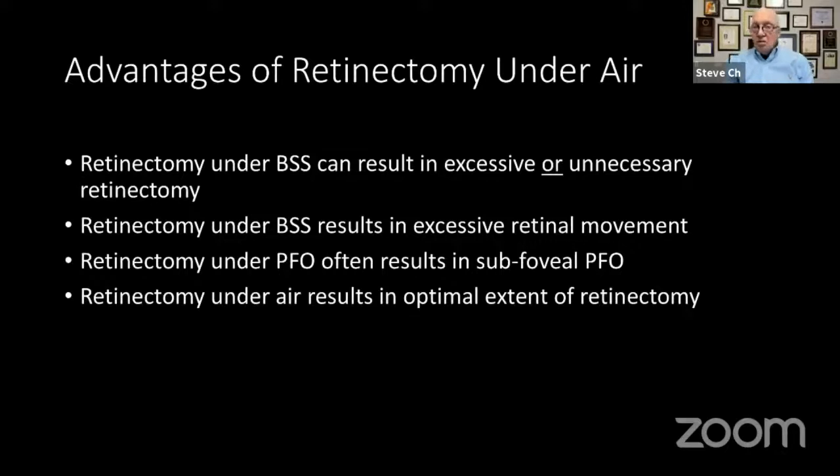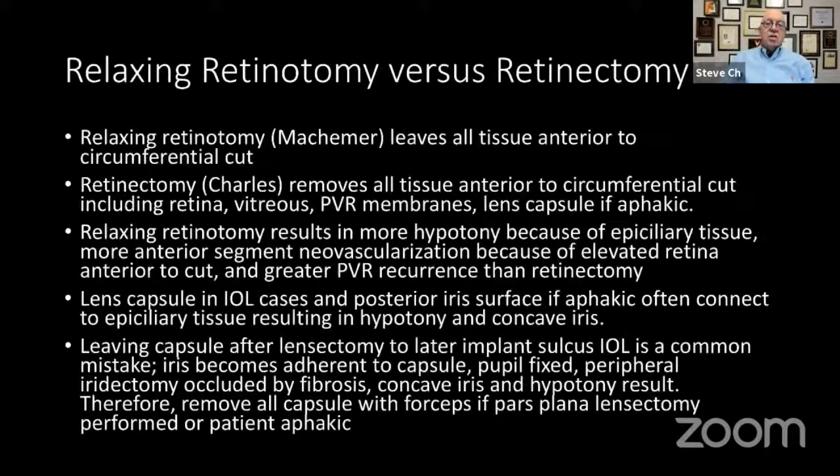If you do it under PFO, these people that put liquid perfluorocarbon in every PVR case are guaranteed to have it in the subfoveal space. When you've got stiff retina, and particularly if there's a posterior break, and you pour in PFO, you're going to make breaks. PFO is essential for inferior detachments, and you leave it in place for 2 weeks. It's essential for giant breaks, as Stanley Chang taught us, but don't use it in PVR. It's massively overused.